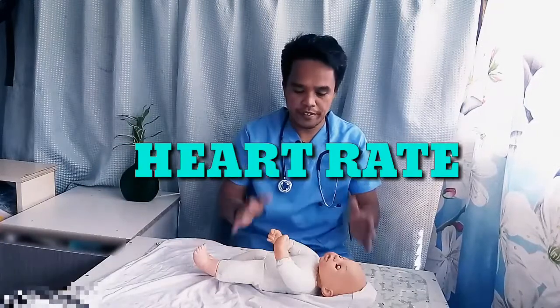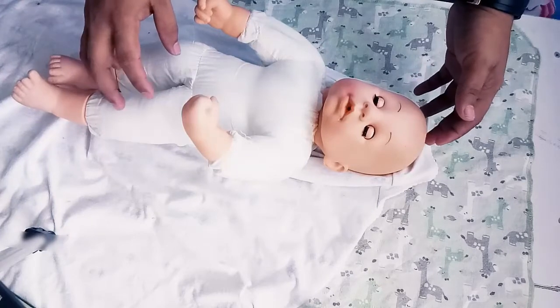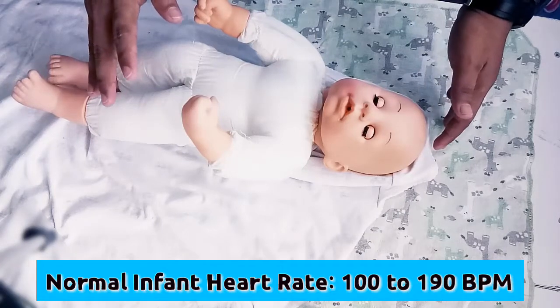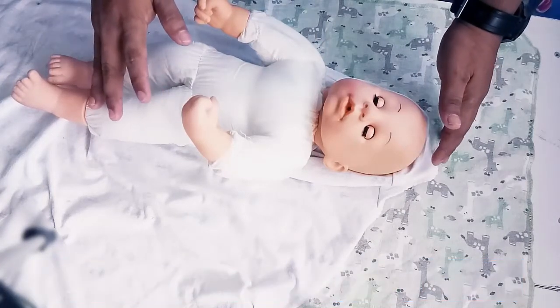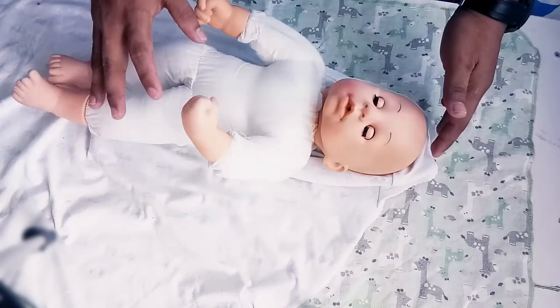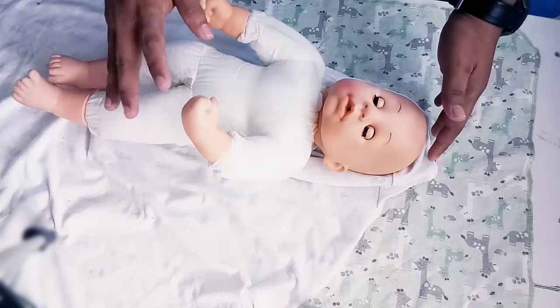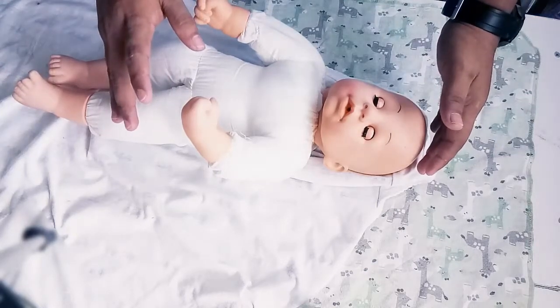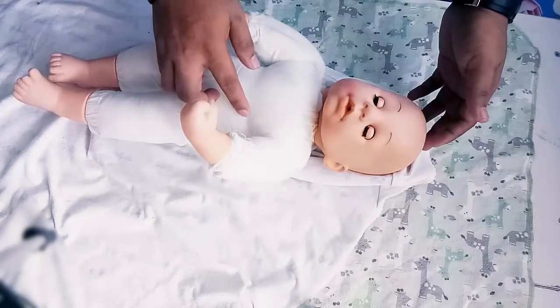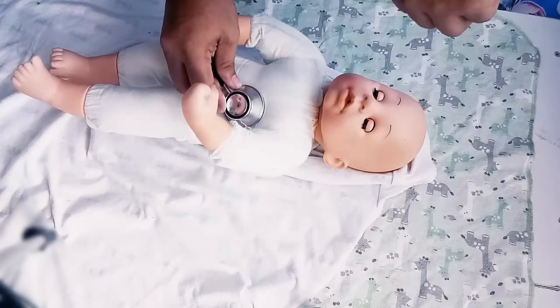Now we're going to get the heart rate of the infant. We're going to use an infant-size stethoscope. An infant who is less than a month old, the normal heart rate is about 100 to 190 beats per minute. This can vary if the infant is crying or sleeping. To count the heart rate, we're going to use the apical pulse — not the radial pulse. We place the stethoscope here at the apical pulse area and we're going to listen for one full minute.